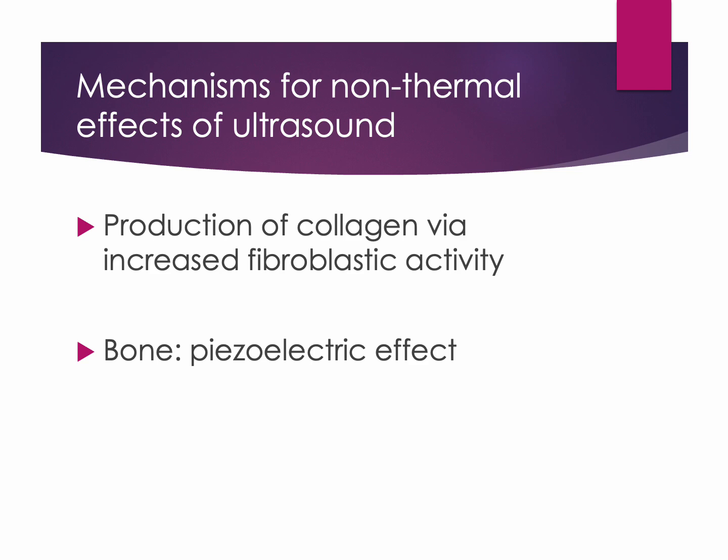These electrical signals are thought to help stimulate cellular activity involved in bone repair and remodeling, which is one reason low-intensity pulsed ultrasound has historically been investigated in fracture healing and delayed union research.